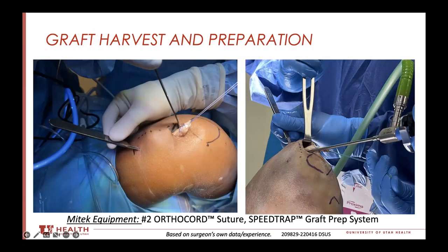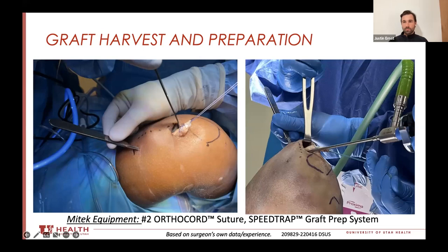What was the learning curve on this graft harvest technique? In the Australian market, there's a specific Arthrex quad tendon harvester that's probably the most commonly used. How did you go about going down this road of this graft harvest technique? Where I learned quad ACL from was a guy who was an Arthrex guy — he would do this manual release with the scissor but then use the quad pro harvester or the cigar cutter to just release it, rather than making the little stab incision.